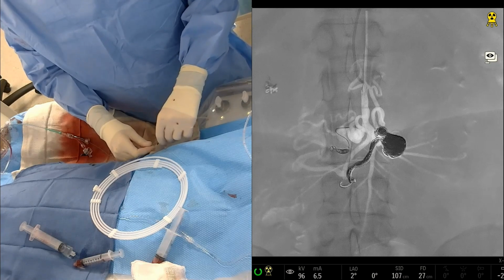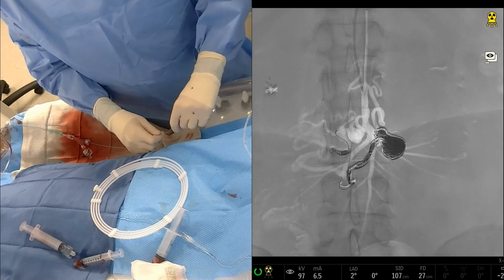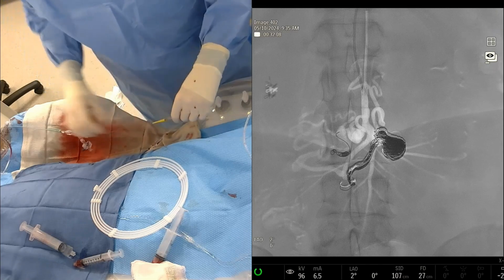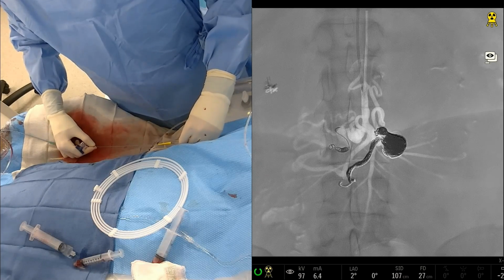Now, just more of a technical note. Would you think about reducing your microcatheter in that aneurysm sac, or do you like to have it looped? You can pull the microcatheter back a little bit, right? We tried, and it wouldn't reduce.